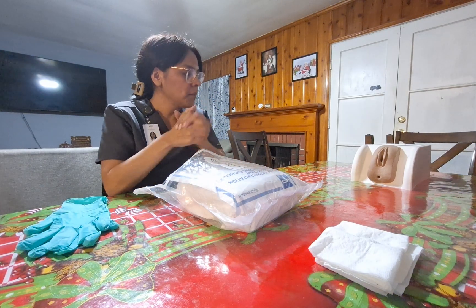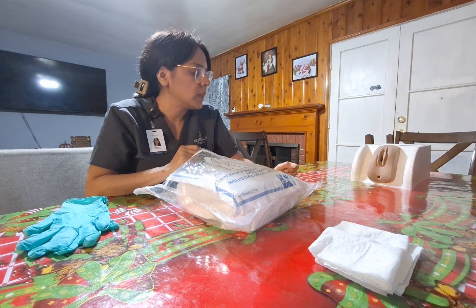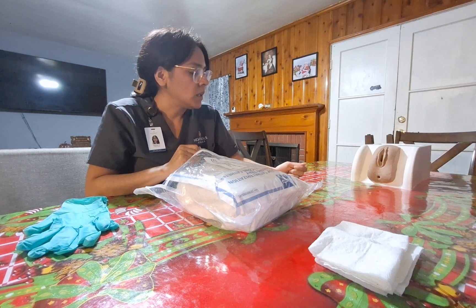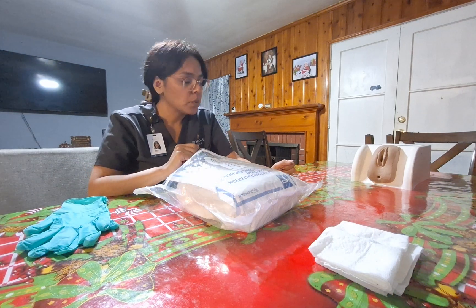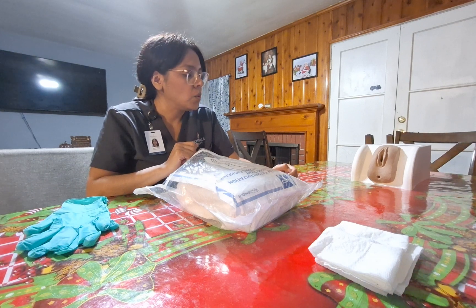Hi Mrs. Garcia, my name is Stephanie and I will be your nurse today. Can I please have you verify your first name, last name, and date of birth? Thank you so much. The doctor put in an order to place a Foley catheter into your bladder — the tube will drain the urine into a bag. Is that okay to do? All right, thank you so much.